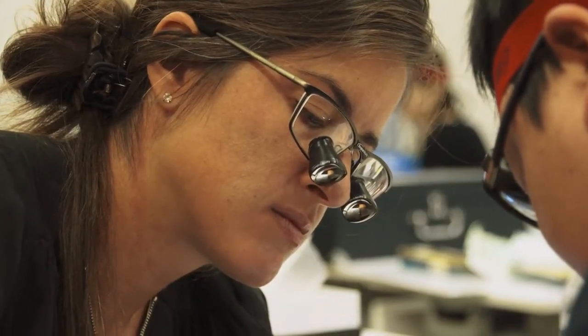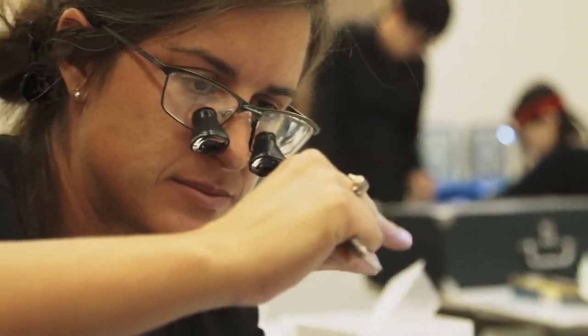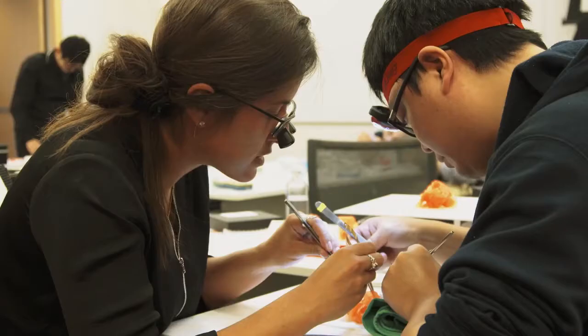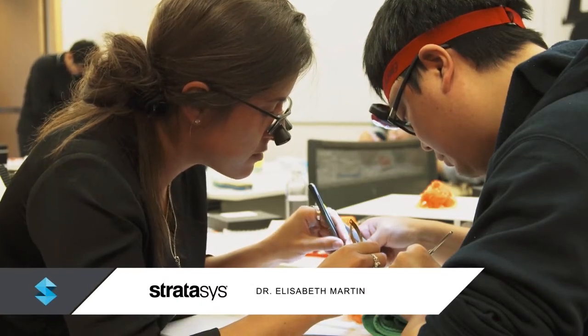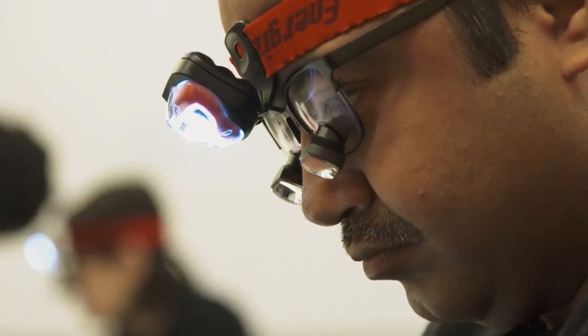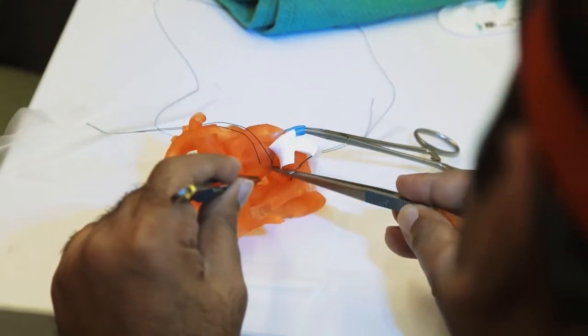I think it's awesome practicing on a specific model to actually perform the surgery. It's necessary — it's mandatory for cardiac surgery as well. The new material has better elasticity, better strength, so for the surgical procedures the new material is absolutely much better.